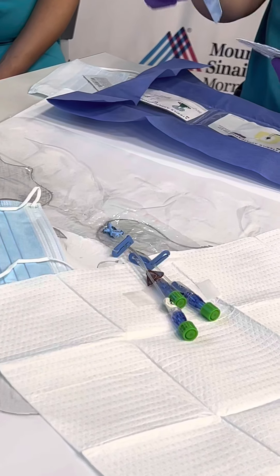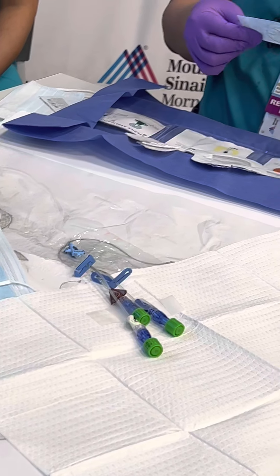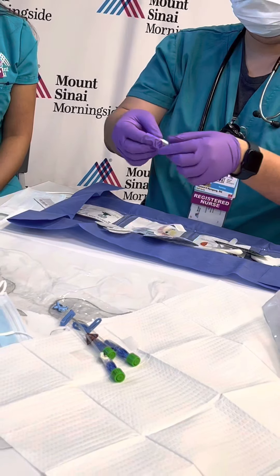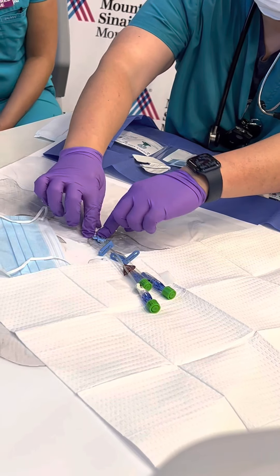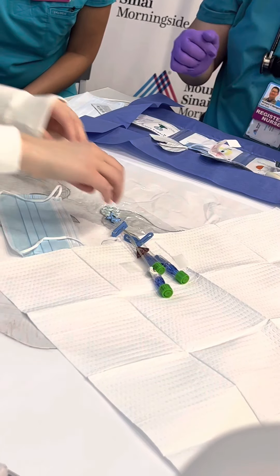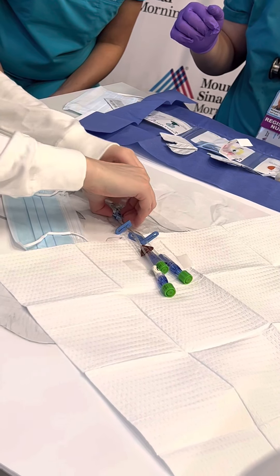Which direction does our biopatch face? Up. And which side faces up — blue or white? The blue one. Sometimes the sutures are a little bit too tight and you can't quite get it underneath. In a perfect world, the sutures would be a little bit looser. Sometimes you might need to use a pair of clamps. You should be able to get it up and under the catheter insertion site.